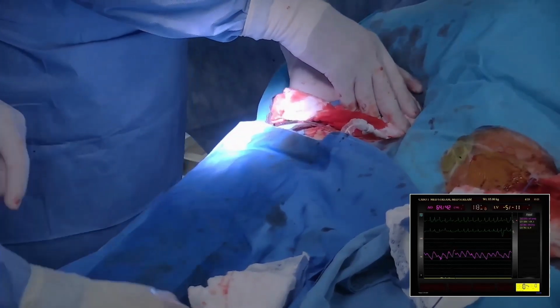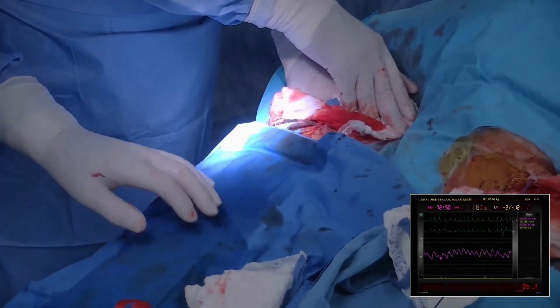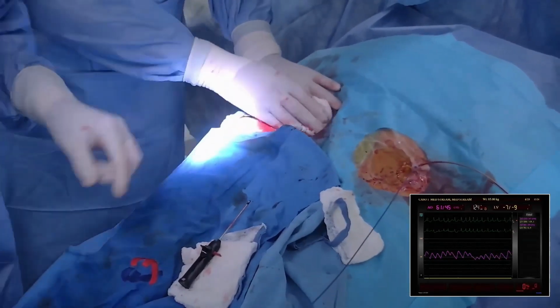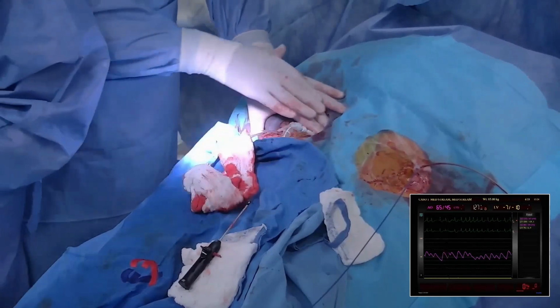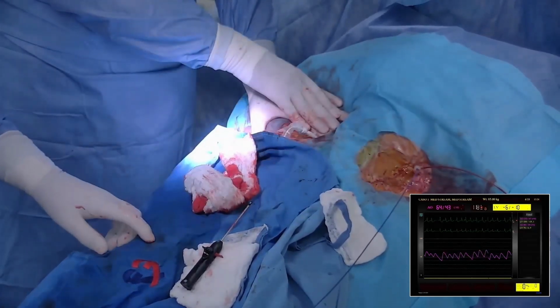So Franco is going to hold for a minute and we will close the skin. So consider that she's a heavily obese patient. We will close this groin with the 8 French angio seal.